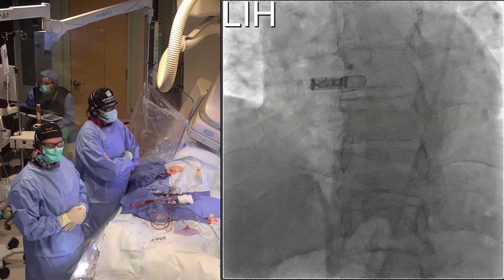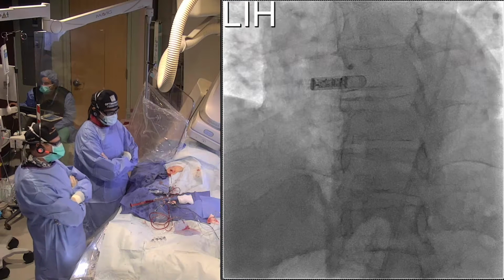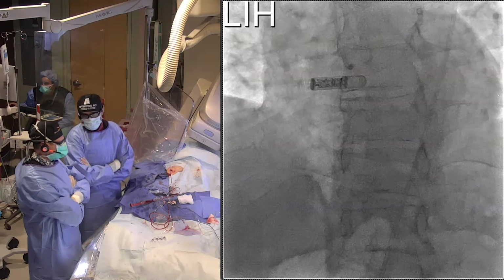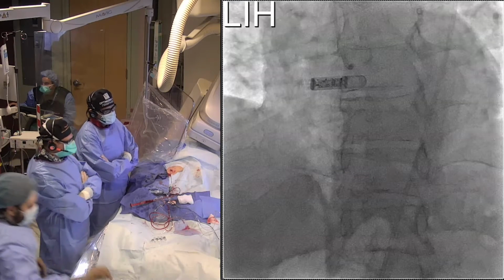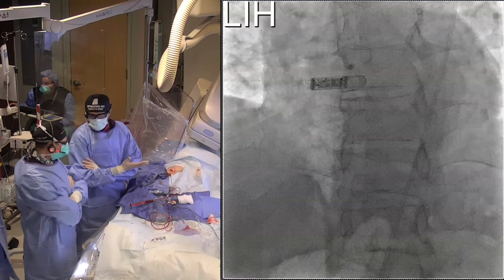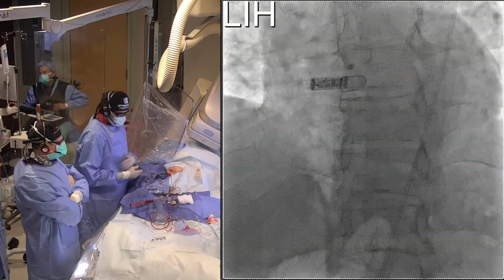What's interesting to me about this case is that I'm wondering if that might be the culprit, because I ended this case previously with kissing balloon inflation. I thought I had a moderately good result and decided not to stent that reasonably sized diagonal. Interestingly, his right coronary is exactly the same, but the diagonal's worse, so I'm wondering whether that's a symptom. Possible.